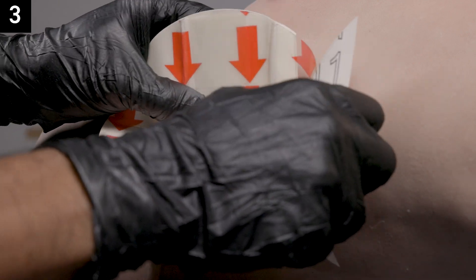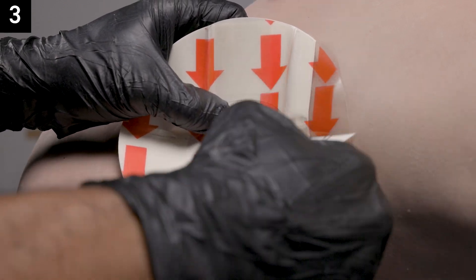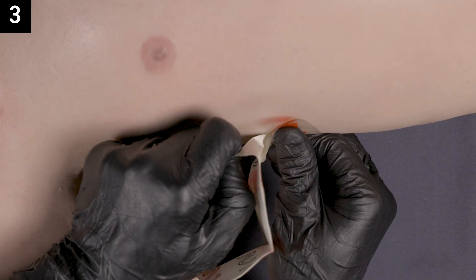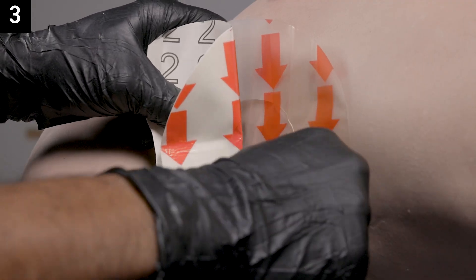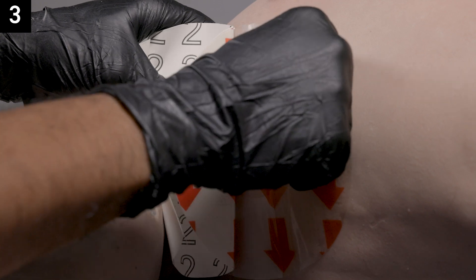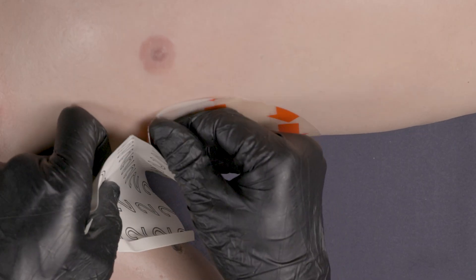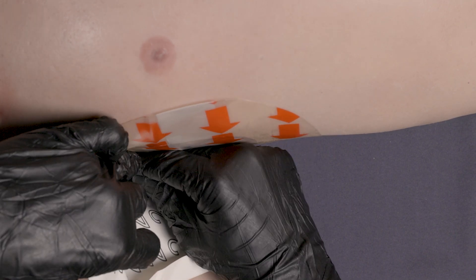Step three: remove adhesive liner 1 and apply that side of the seal to the wound, then remove adhesive liner 2 and securely adhere all adhesive edges. It's important to adhere the edges with no bubbles to ensure the chest seal ventilates properly.